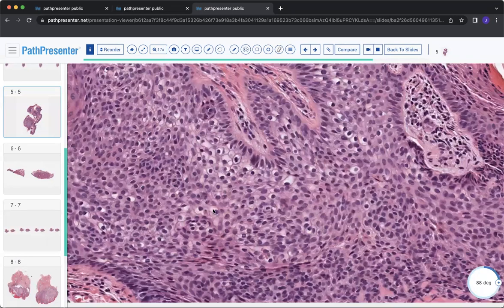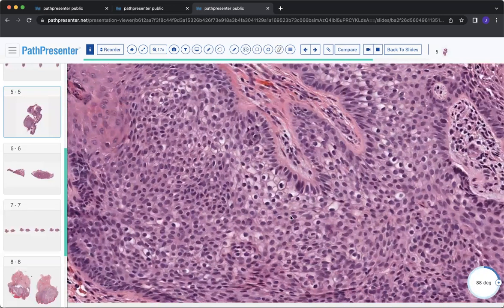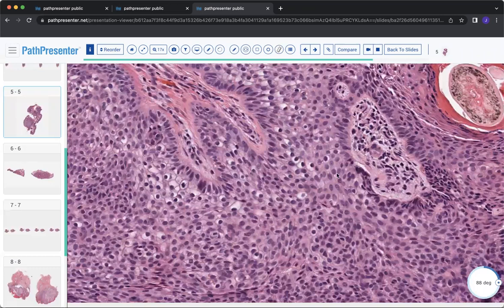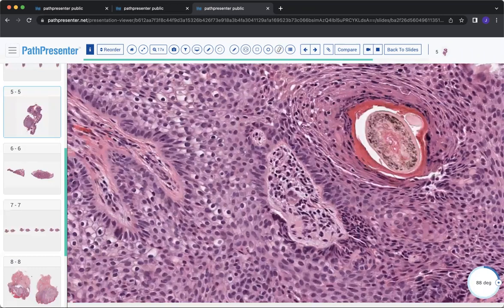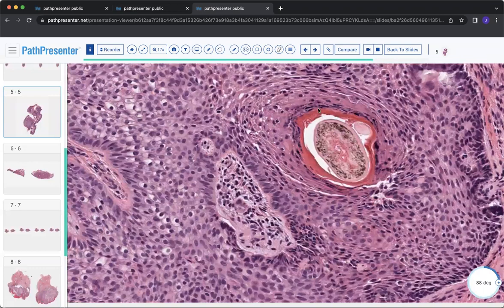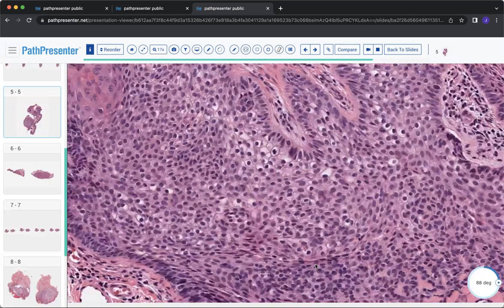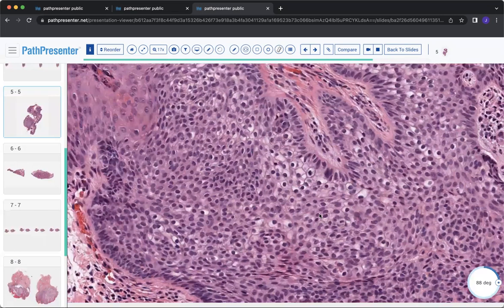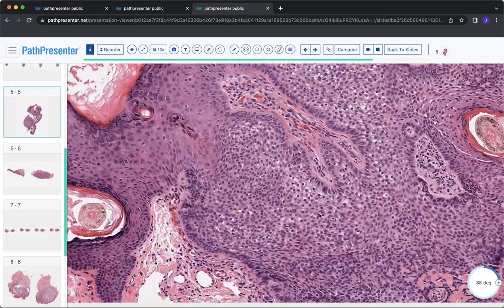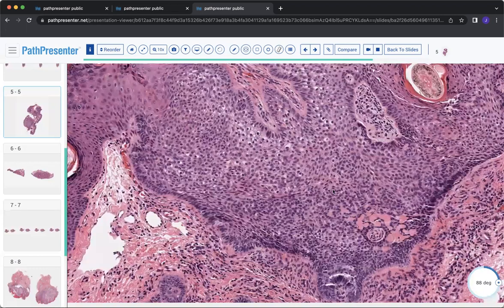The other thing is, interestingly, CD34 beautifully highlights the clear cell population. And remember, CD34 typically marks endothelial cells within blood vessels. It marks more primitive derived cells. Many soft tissue tumors highlight with CD34. So if there's any doubt, or if you have a small sample, you definitely want to do those immunostains for CD34 and BerEP4.